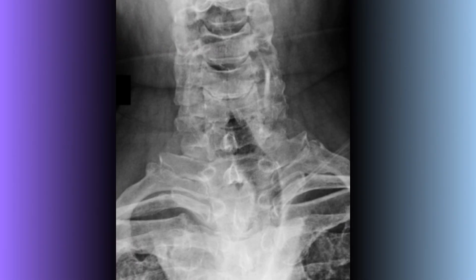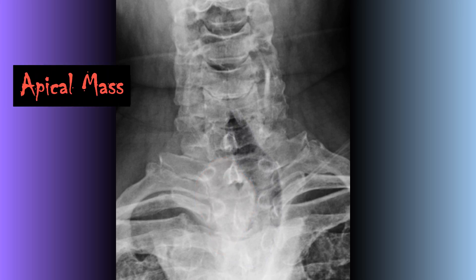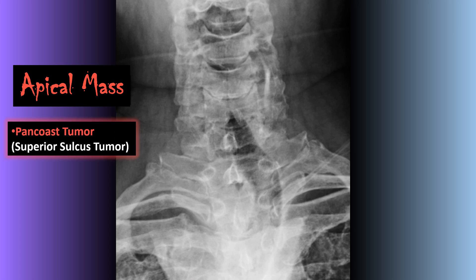Here's a good example of a lung pathology seen on a non-chest film. On this frontal view of the cervical spine, you should see a focal deviation of the tracheal air shadow to the left, being pushed by this large space-occupying lesion within the right lung apex. This ends up being an apical mass, or a Pancoast tumor — an aggressive lesion within the chest.